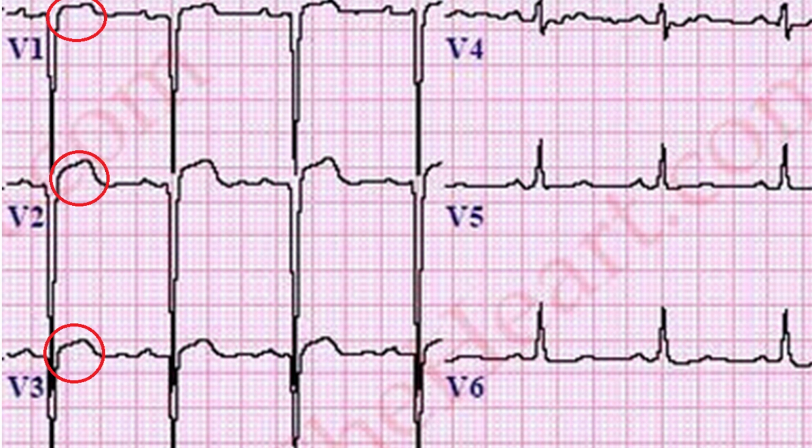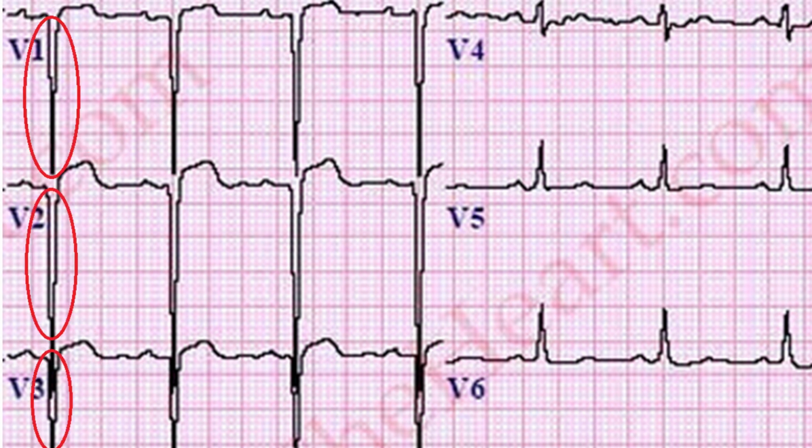One characteristic of patients with left ventricular aneurysm is that they have persistent elevation of their ST segment. So, if you were to randomly perform an EKG on an asymptomatic patient with left ventricular aneurysm, chances are they will have persistent ST elevation, even though that doesn't represent an ongoing ischemic event. Another key feature of EKGs in patients with LV aneurysm is the presence of Q waves. After all, these patients have had a previous MI, so that shouldn't be surprising.